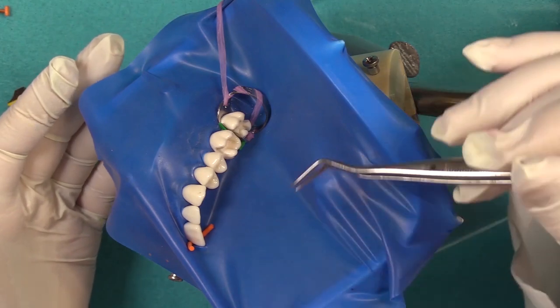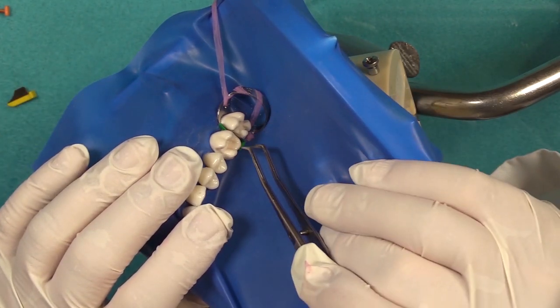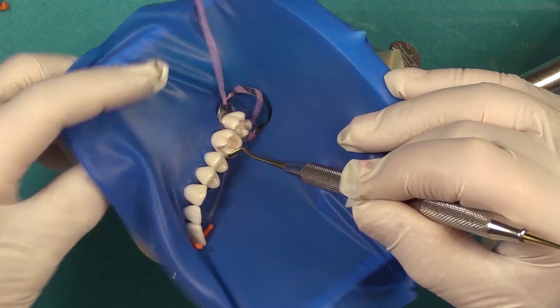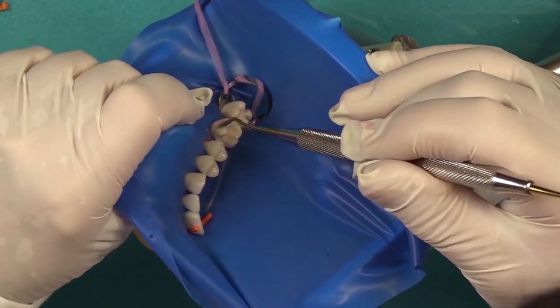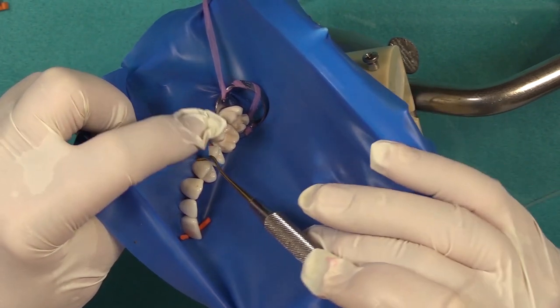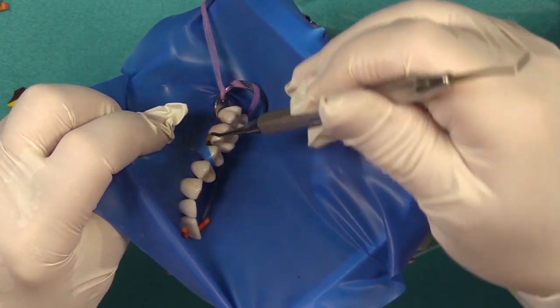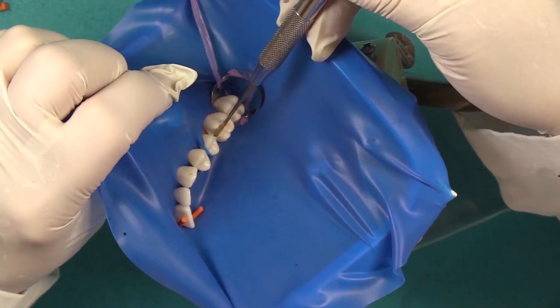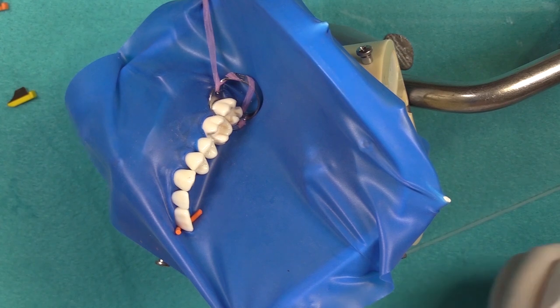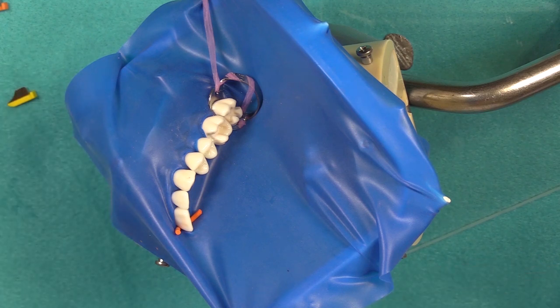Then you can go ahead and prepare your tooth, importantly without causing damage to the adjacent tooth. Once your tooth is prepared, you can remove your fender wedge. Another option is to lift the interproximal dental dam with a composite instrument and reposition the dental dam while you're doing your preparation — to prevent tearing. When you've prepped it, you can reposition the material back into place. I like the fender wedges because they give you the added benefit of protecting the adjacent tooth.